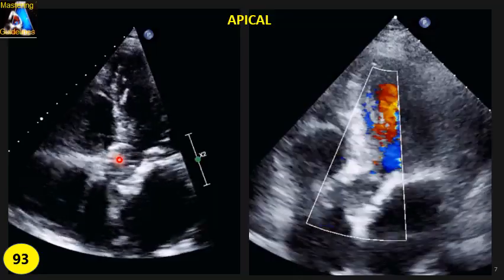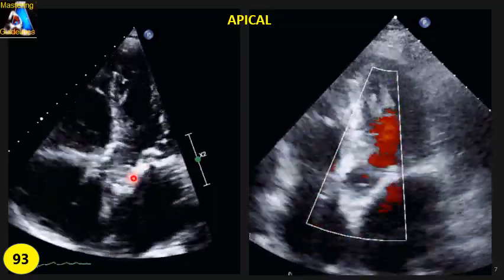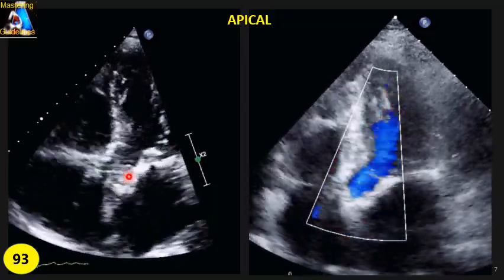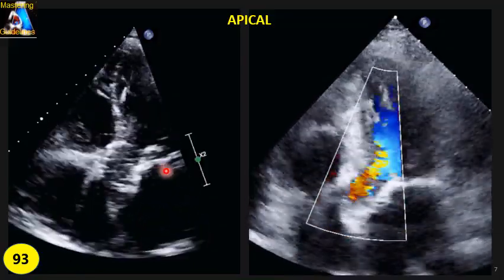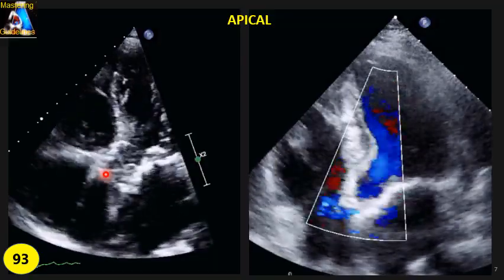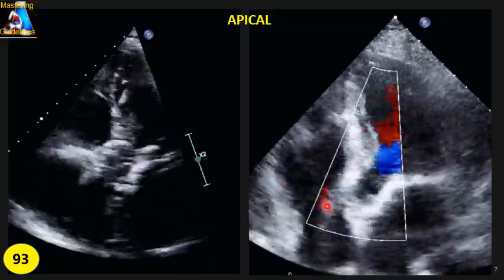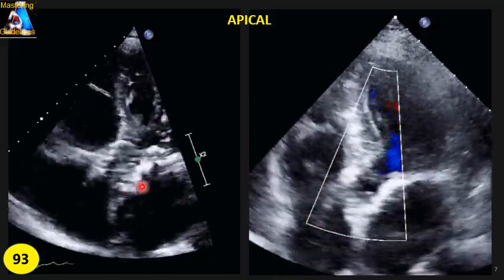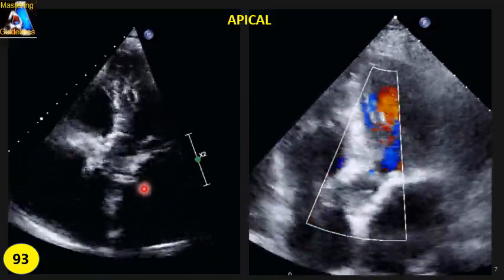The third feature is the frame or mesh shape: many hyperechoic lines running horizontally parallel to each other. To see this feature, you have to sweep or fan up and down. When you go slightly to the side of the valve, you can see that mesh pattern clearly, and it gives you the hint that this is a TAVR.